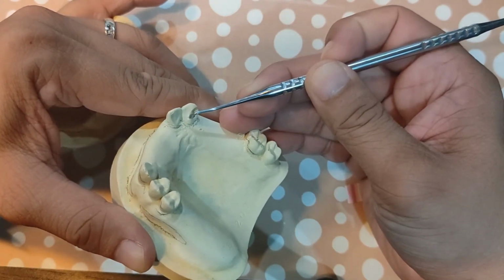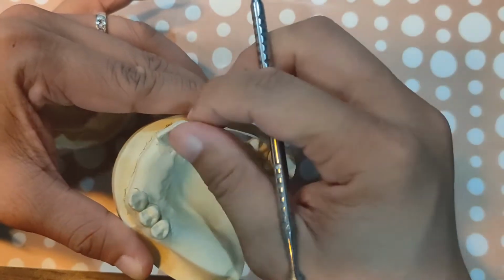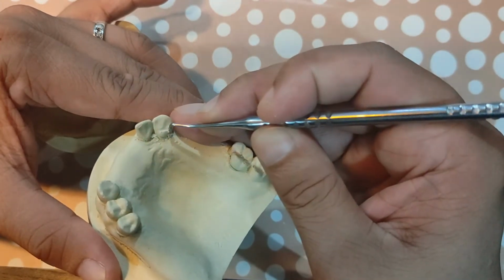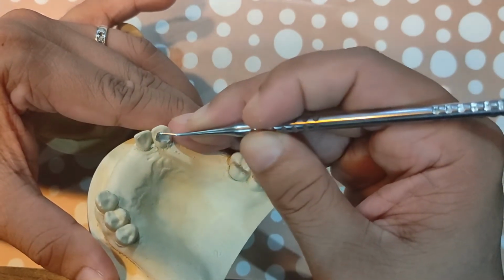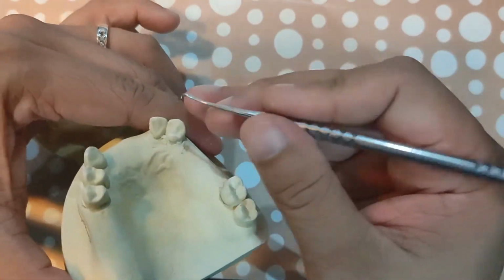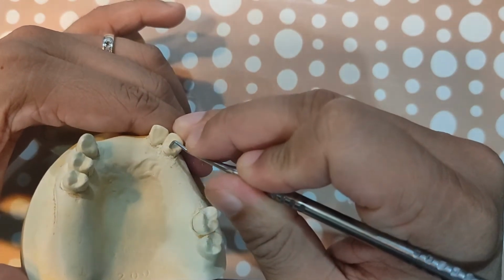Okay? Alright. And when you're creating cingulum rests, you will invariably reduce the lingual slope as well. Hindi mo iwasan yan.